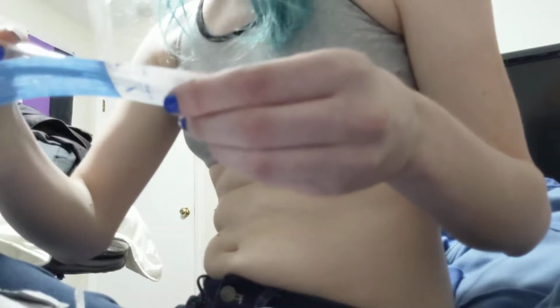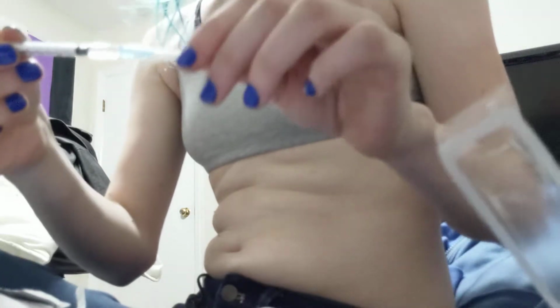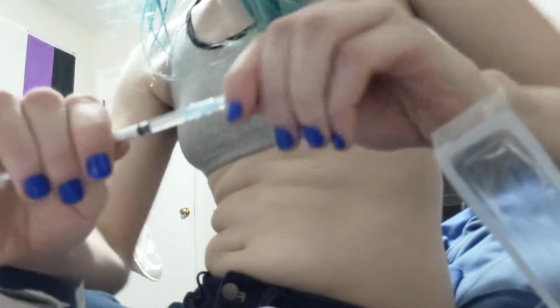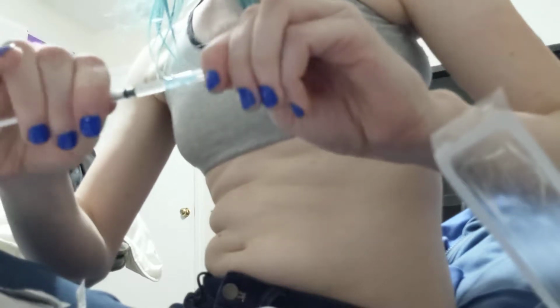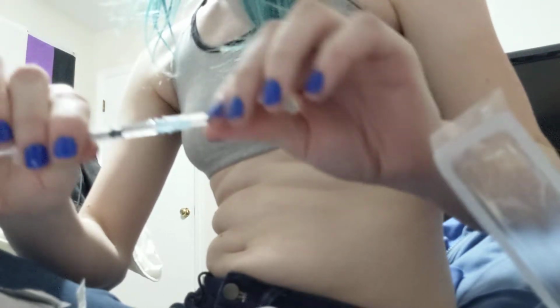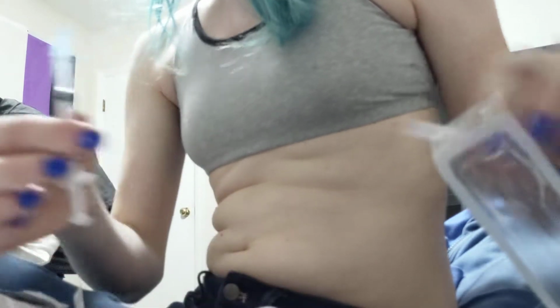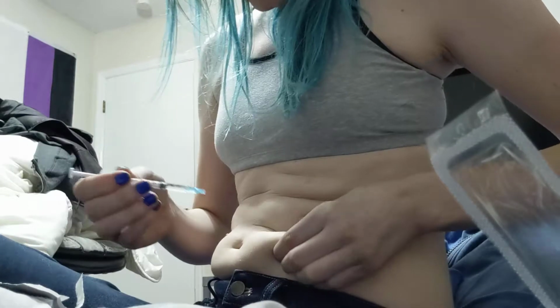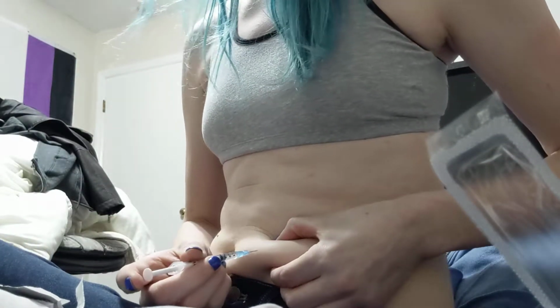Alright, you want to take your syringe out with the new smaller actual injection needle, and you want to make sure the needle isn't going to fall off. This is not a luer lock, so you need to make sure it presses on so you can get the actual cap off without pulling the needle with it. Then you want to pull it off, and now we just have the needle itself. And you want to find where you did that.